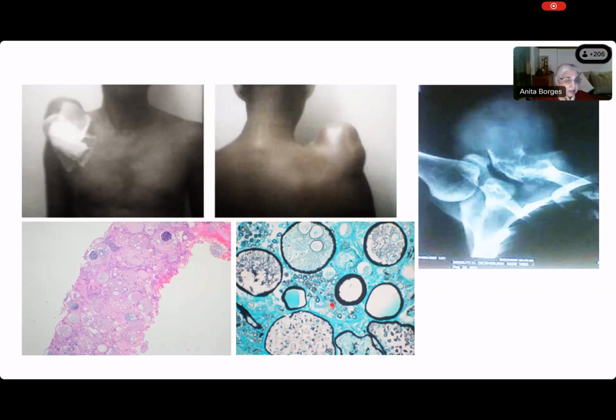Parasite. Okay. Do we use the GMS stain by and large for parasites, or do we use the GMS stain for fungus? Fungal infections? Wow, very good. So which fungus do you think this is? What do these look like? These big structures that you see? Sporangium. Somebody said something. Who said that? Monica? Sporangium. Sporangia. Yes.